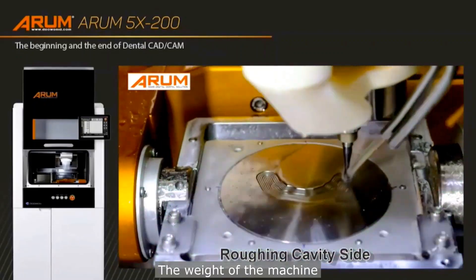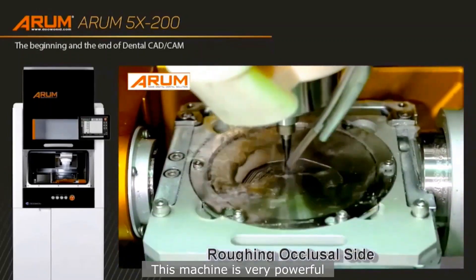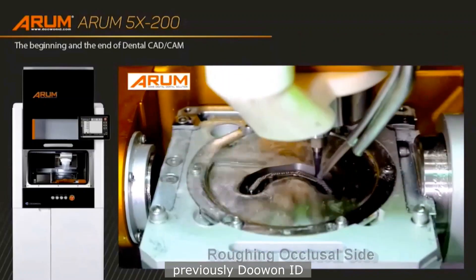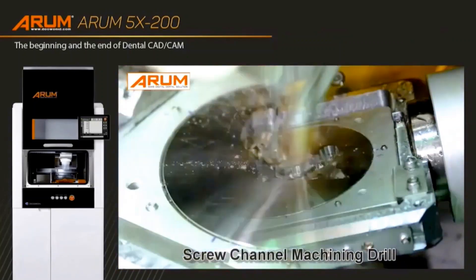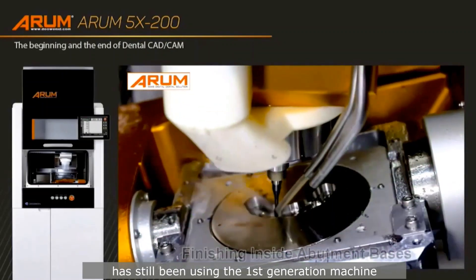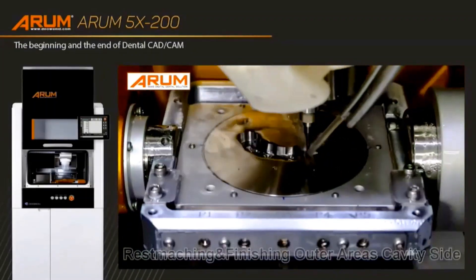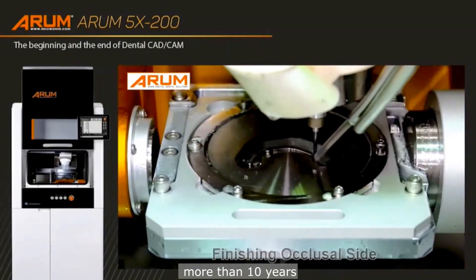The weight of the machine is about 900 pounds — very powerful and heavy enough. Interestingly, this company, Arum Dentistry, previously known as Doowon ID, made the world's first dental metal milling machine since 2008. One of my customers in San Jose, California, is still using the first-generation machine since 2009 to mill metal.